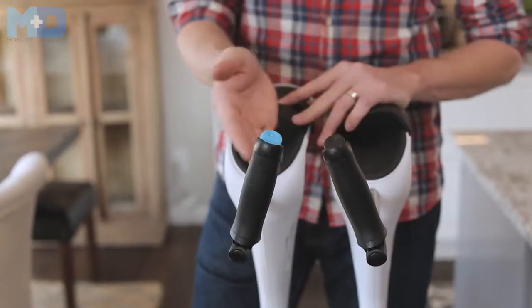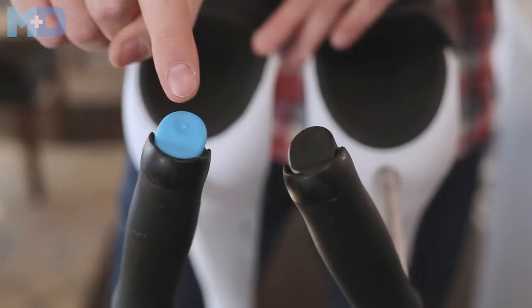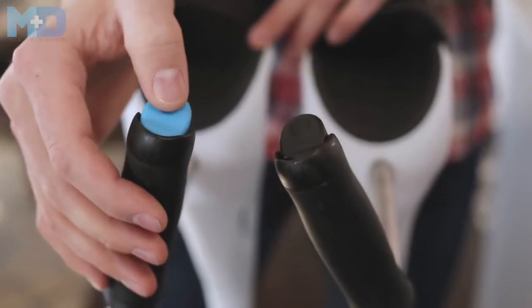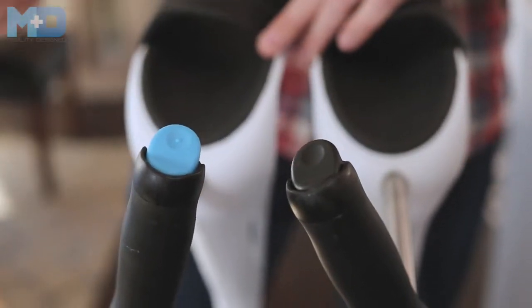The handles are left and right specific. The right handle has a blue button with a braille dot to signify which one is the right handle. The braille dot allows you to feel it in the middle of the night when you don't have any light.